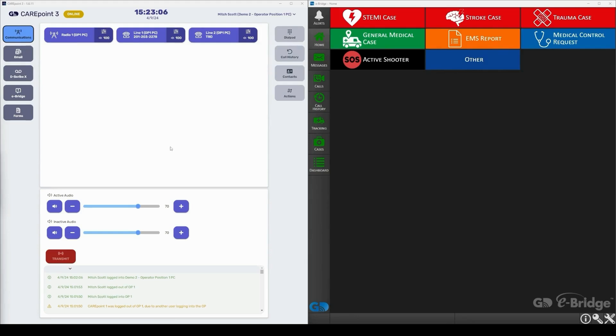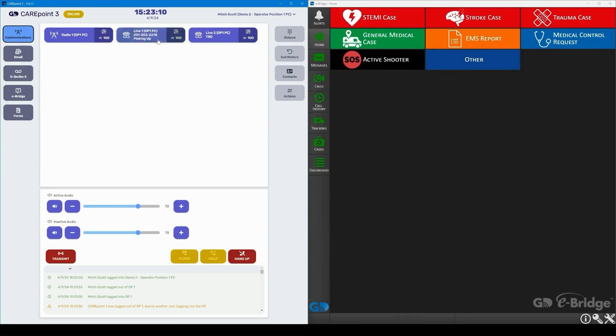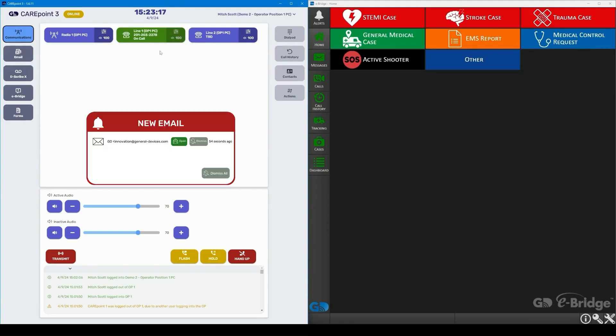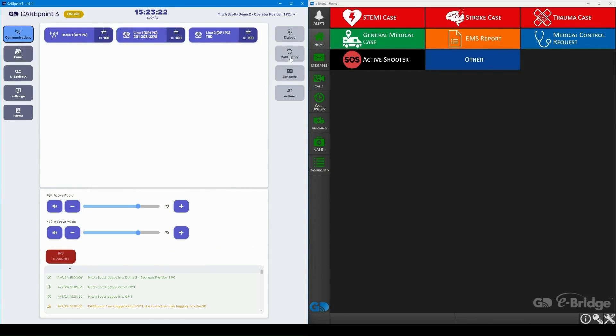Let's go ahead and show how this is done. We have an incoming call from Medic1 to alert us of an incoming STEMI case arriving to the ED in 10 minutes. Here we see the alert where they sent us 12 leads via email, let's dismiss it for now.